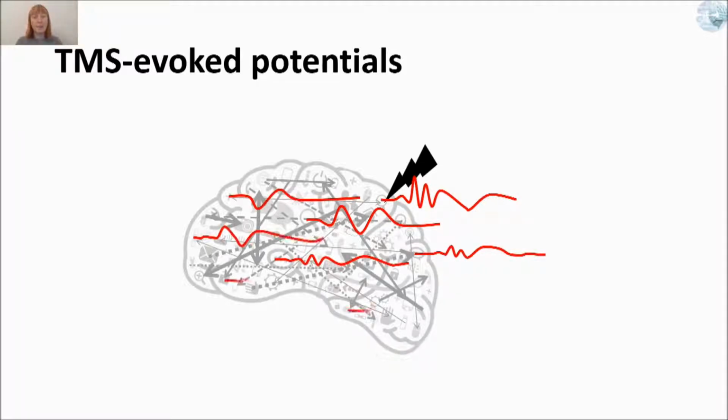So, in principle, if we were able to monitor EEG data quality in real time, we could adjust TMS parameters to improve the signal-to-noise ratio. In other words, we could take advantage of the EEG readout to prevent the occurrence of clear-cut artifacts and to increase the impact of TMS on the cortex.